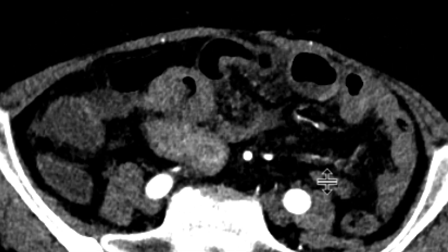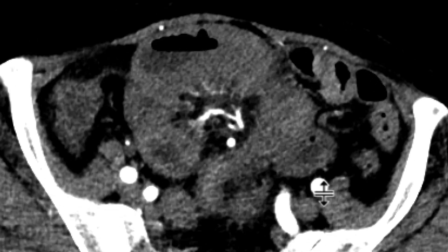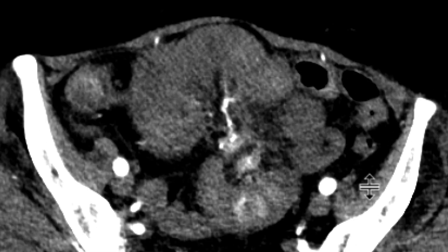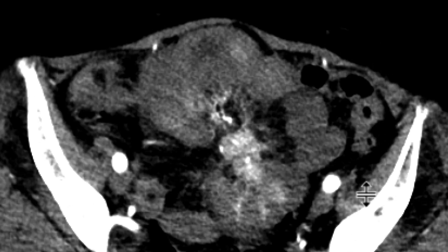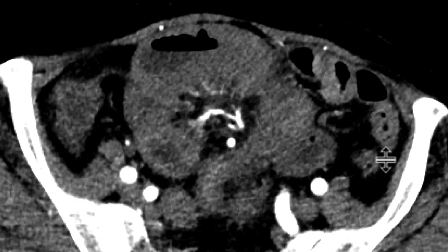As we scroll downwards, we can start to appreciate the abnormality — a heterogeneous mesenteric mass that's hypervascular. At the periphery, there appears to be some tethering and spiculated margins, extending outwards to numerous loops of small bowel that are tethered to this location and are a little bit distended.